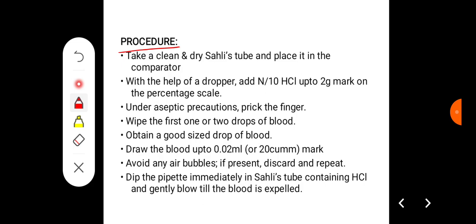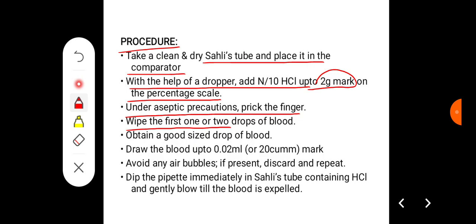The procedure: take a clean and dry Sahli tube and place it in the comparator. With the help of a dropper, add N/10 HCl up to the mark of 2 grams on the percentage scale. Under aseptic precaution, prick the finger. Wipe the first one or two drops of blood and then obtain a good sized drop of blood over the fingertip.